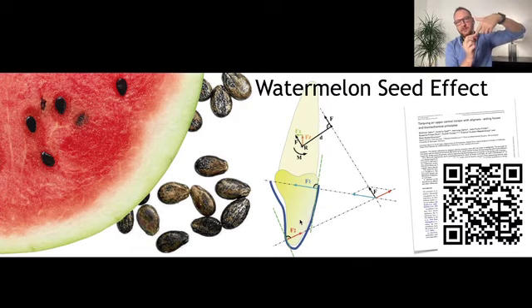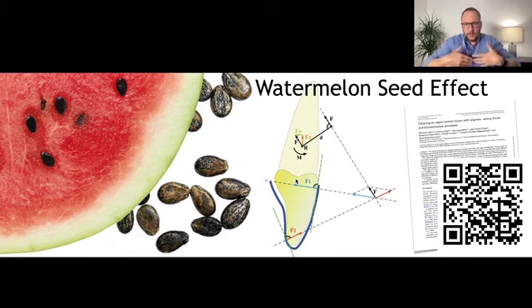So even if we start just a simple movement like a crown buccal inclination, if we start moving, we are going to start having contact in this area here, and then we're going to have contact in this area. It's more or less like doing this with the seed of the watermelon. And we have an intrusion component here. Then we start to also intrude. If you want to procline the crowns and intrude, amazing. You don't need to place an attachment here.